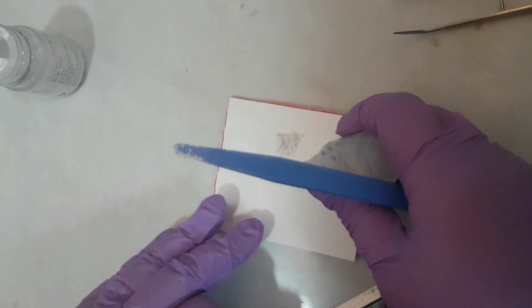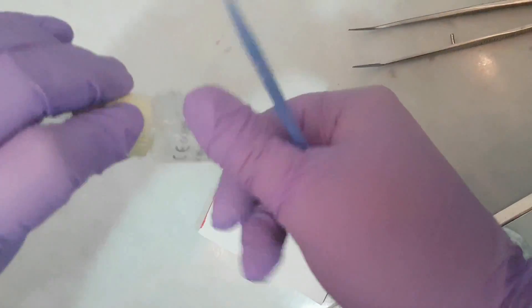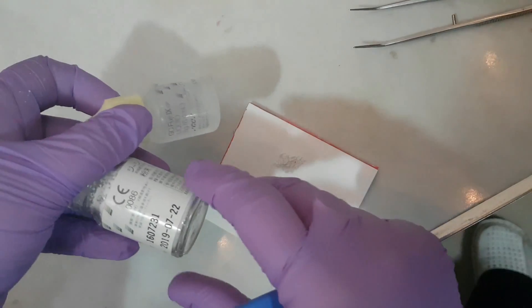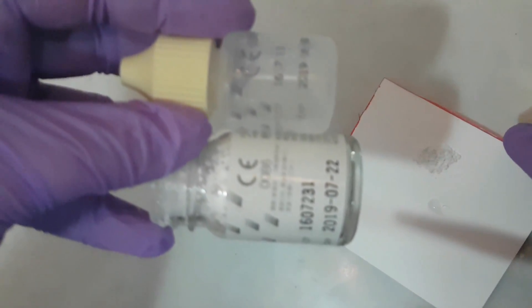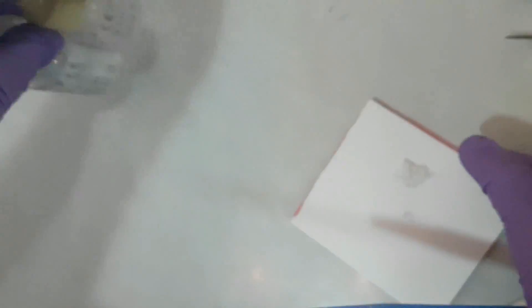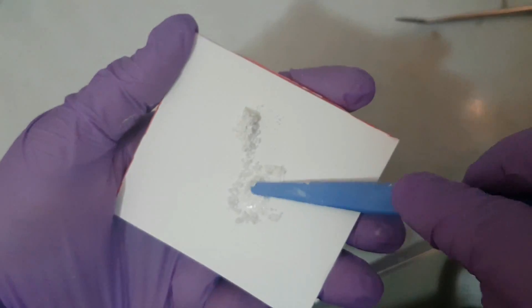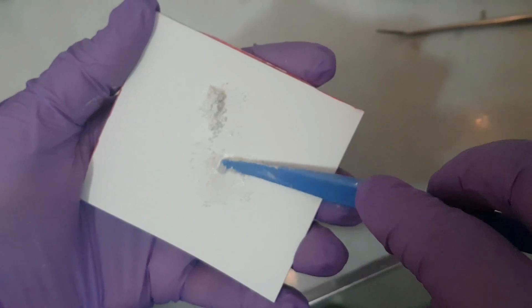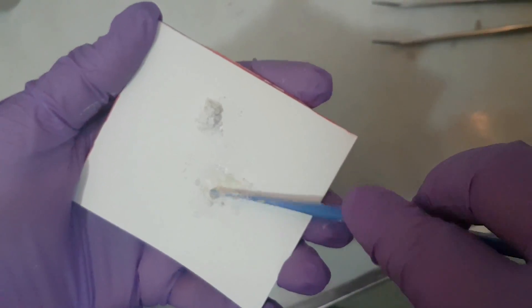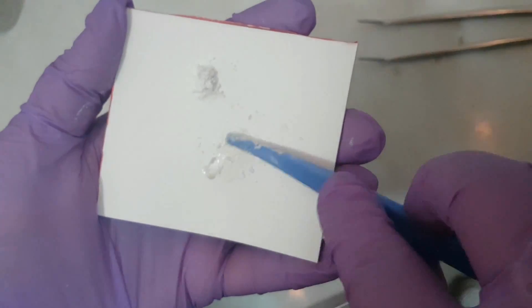This is how we prepare the glass ionomer cement. It has a powder and a liquid component which we mix together. You can see the bottles as they are sold, and here you can see the mixing of the two components.